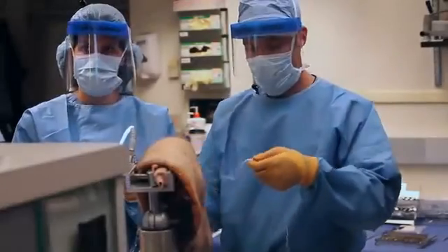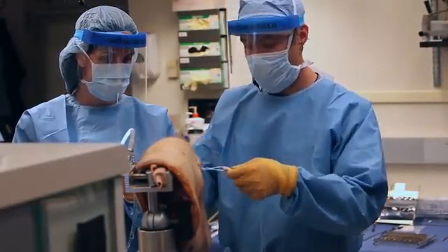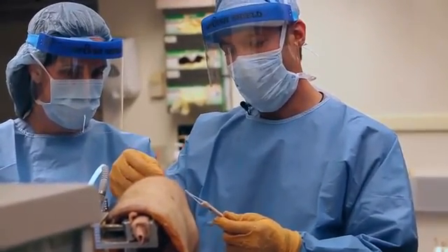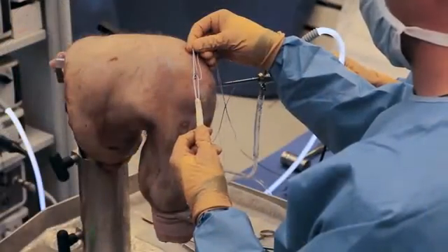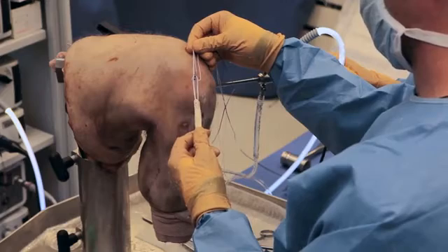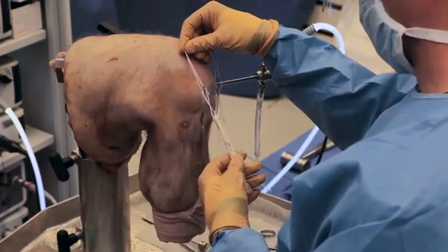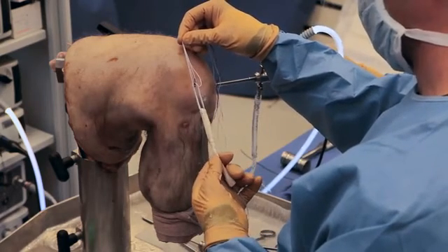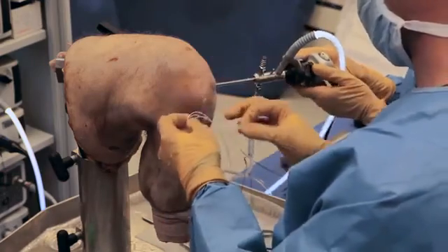So we're going to use the Biomet toggle lock with zip loop. We've pre-zipped this zip loop to 40 millimeters. Our interosseous tunnel is between 35 and 38 millimeters. So we've pre-zipped it. We'll pass it, lock it on the lateral cortex, and then we'll dock the graft into the femoral socket using the zip loop technology.